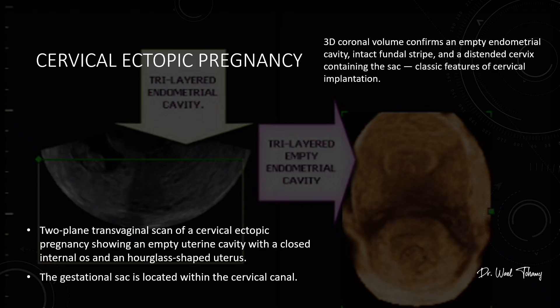This 3D coronal view confirms the diagnosis — the endometrial cavity is completely empty, the fundal stripe is intact, and the cervix is distended, containing the gestational sac. These are classic features of cervical implantation, and 3D imaging makes them crystal clear for both diagnosis and teaching.